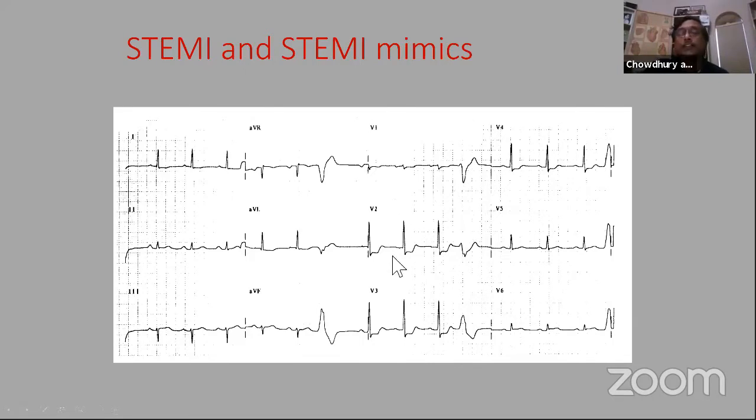Why am I showing this EKG? Because if this is associated with RV involvement and the patient has hypotension, that itself is a bad prognostic marker. Hypotension in the absence of nitroglycerin, in a patient with inferior posterior MI, can be really troublesome. You need to recognize that early reperfusion is good. The earlier we open the inferior, the better, before the RV sustains the MI and starts dilating and failing.